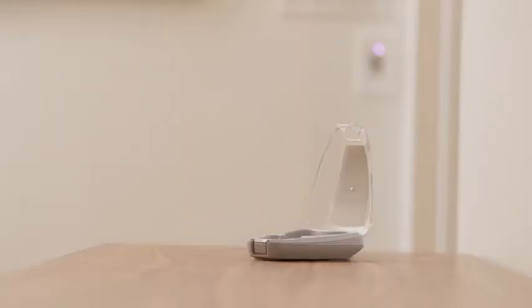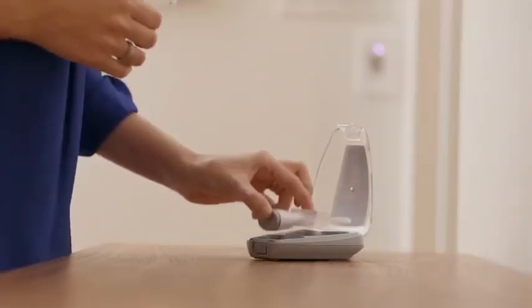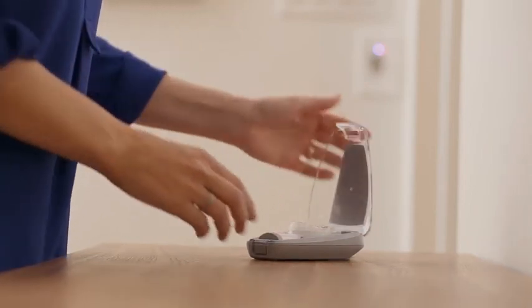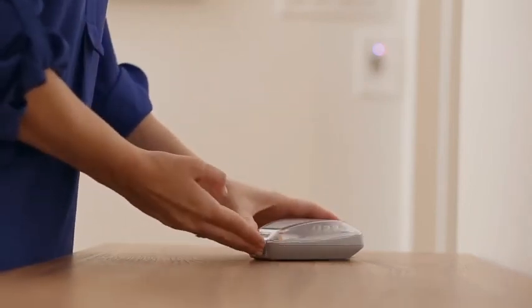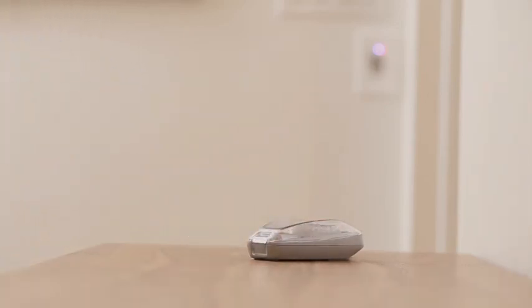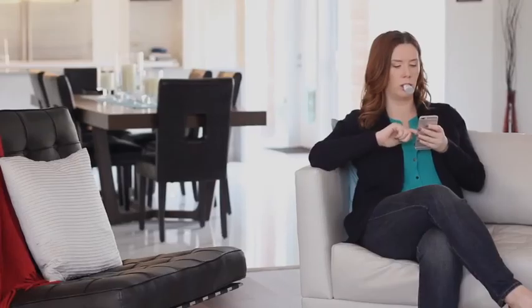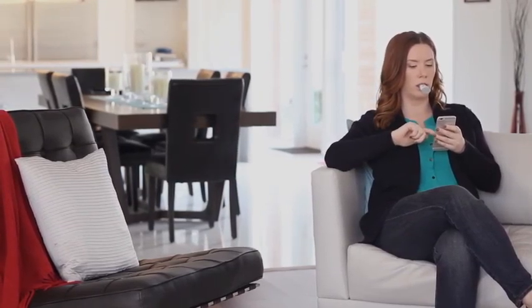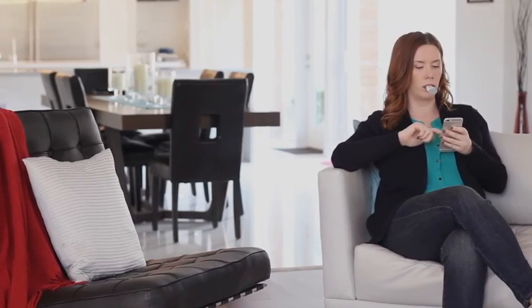Store and recharge the Accelident Activator after each treatment by returning it to the powered charging case. Place the Accelident Activator securely in the charging case to ensure proper charging. We suggest selecting a consistent time for use each day. This way, using Accelident Optima becomes a routine and you may be less likely to forget or miss a daily session.